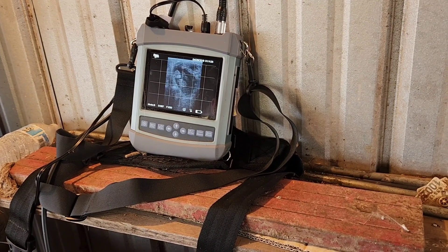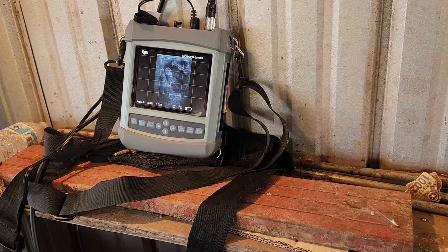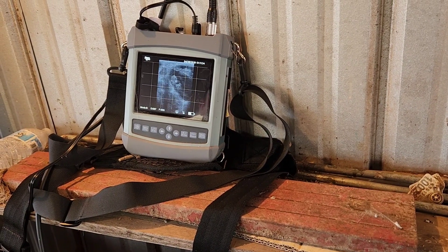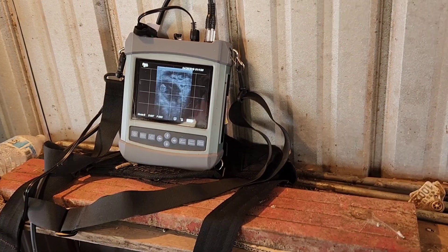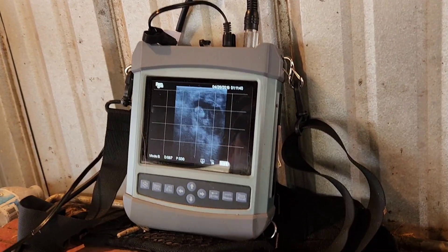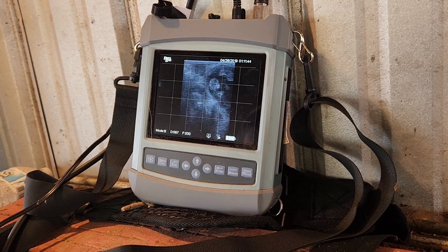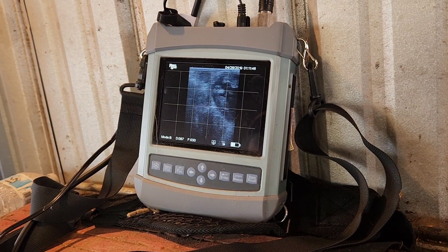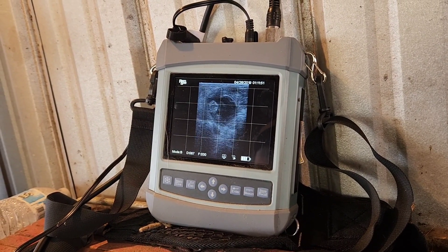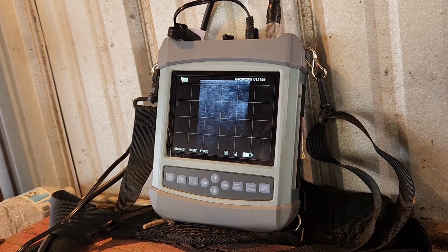You can see a little bitty head — the head is kind of a black round thing. It looks like a beak right there on the cross-section of that grid. He's laying on his back and his head is curling up — going clockwise, head's at 12, and then it goes down around, with 9 being the spine.